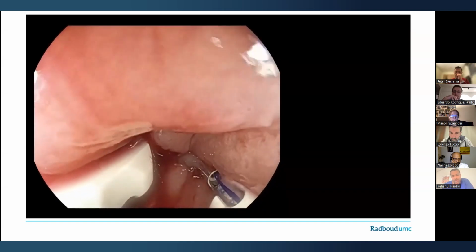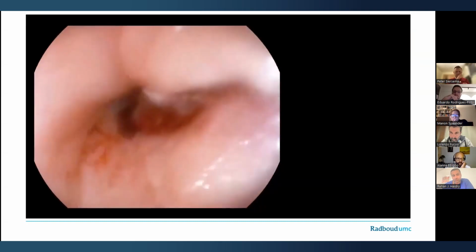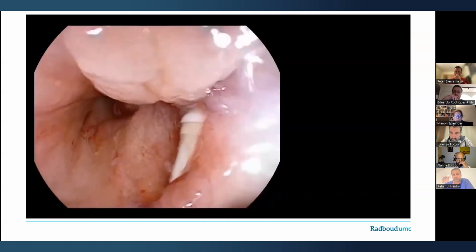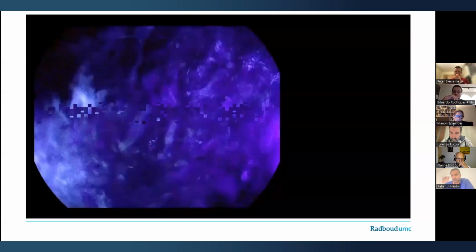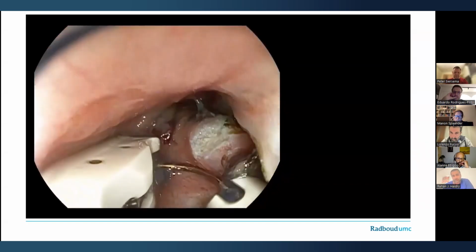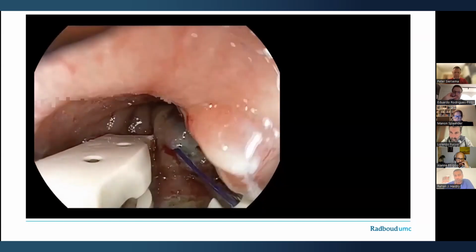What I do then is I basically put methylene blue in my irrigation pump, and then put the intercostal drains on negative suction, and we'll just basically marinate the esophagus for about 5 minutes. And if what comes out of the intercostal drains is still blue, that means I still have a leak. And so then I go back and you can reinforce your first suture and then repeat that over and over again.